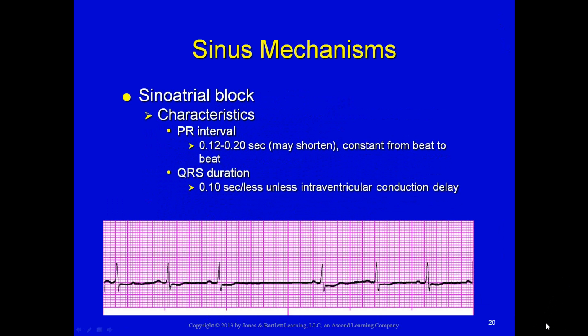The T waves in this particular rhythm aren't very identifiable, but they are there. They kind of dip down below the isoelectric line in the third and the fourth complex that you see, but they're there. But we're missing a beat. If you measured R to R to R all the way across the paper, those R's, P's, and QRS's that occur on the tail end of this strip measure out the same distance as the ones on the front of the first part of the strip.